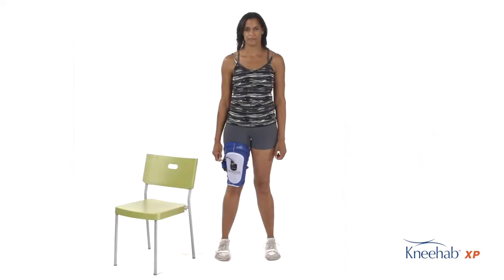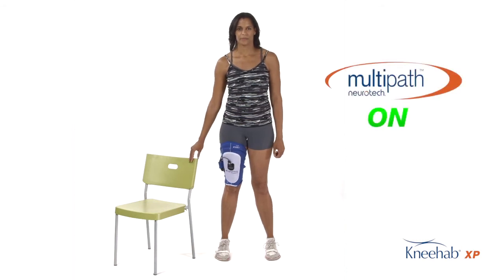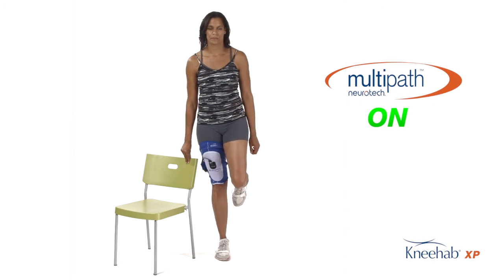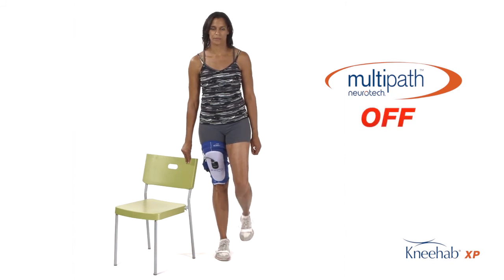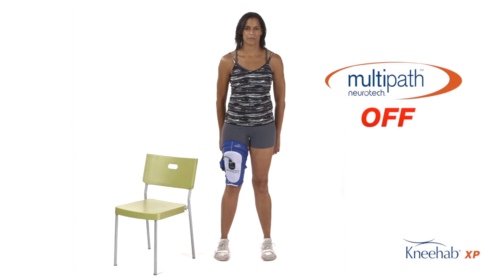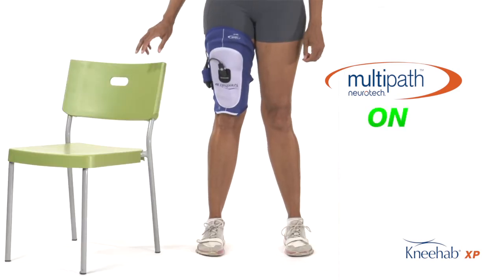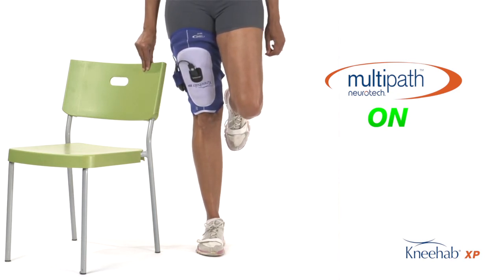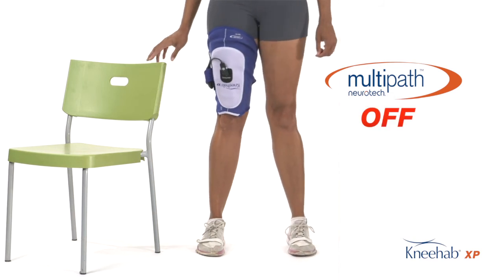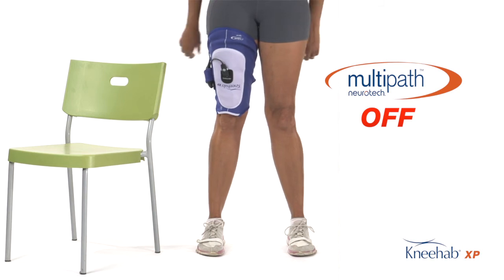For the level 3 exercise in stance, the patient will shift the body weight over onto one leg with the onset of the contraction from the device and squeeze their quadricep muscle along with the device. When the contraction from the device releases, the patient places the foot back down and shifts back to even body weight. They repeat this cycle of shifting over onto the one leg and squeezing with the contraction of the device, and shifting back over to even stance during the rest cycle. A chair may be used for balance support.